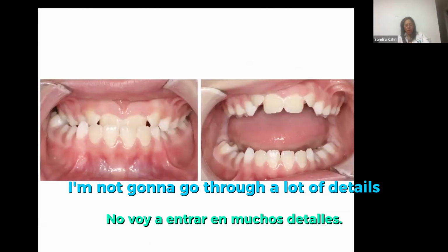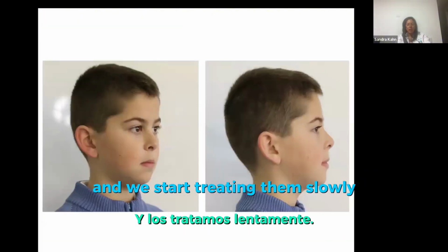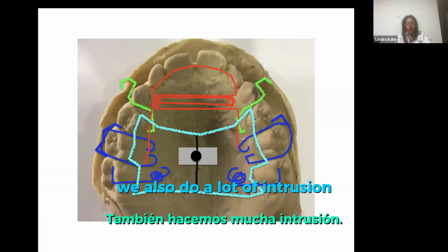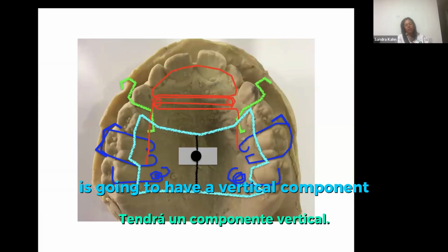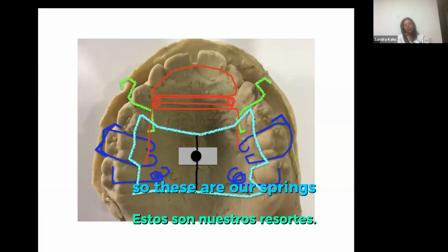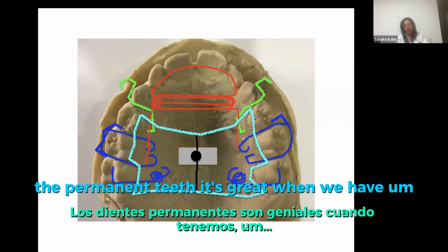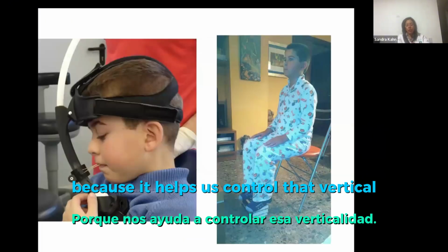I'm not going to go through a lot of details, but we start treating these patients early and we start treating them slowly. We also do a lot of intrusion because every case that we treat with a bow is going to have a vertical component. So these are our springs that help us control vertical and intrude the permanent teeth. It's great when we have deciduous teeth because it helps us control that vertical.